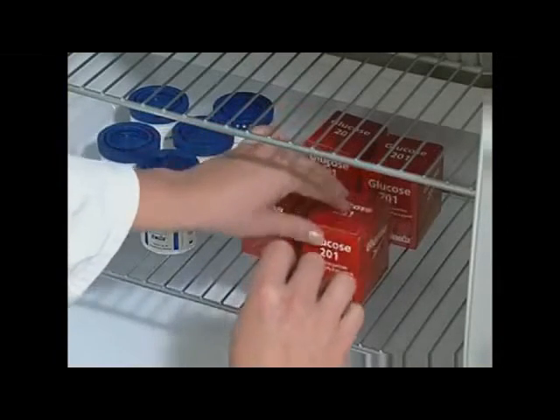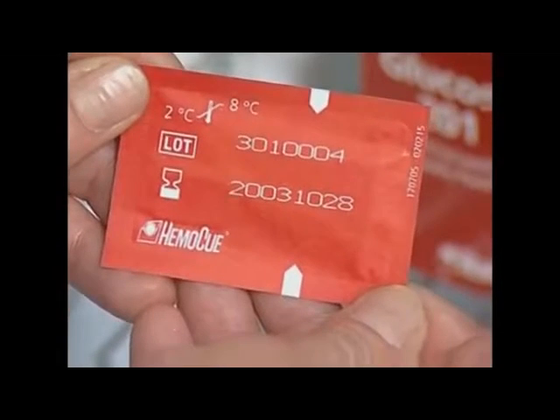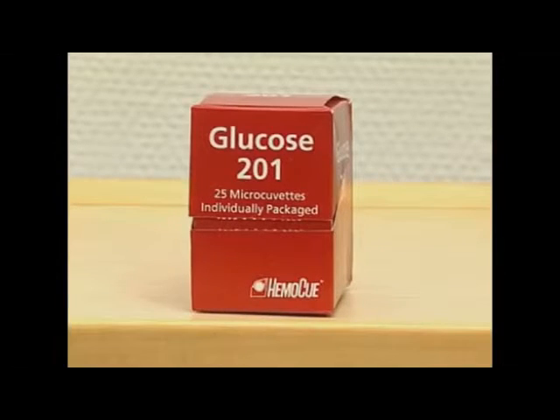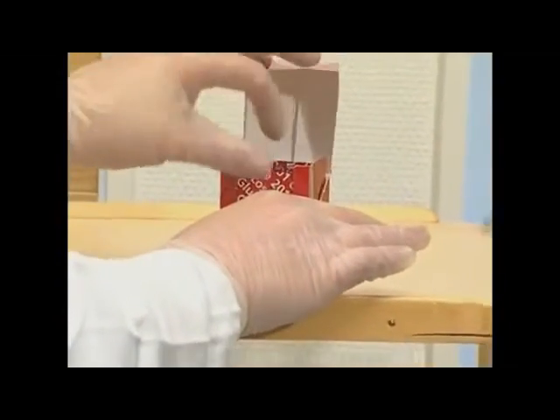Each individually packaged micro cuvette is stable until the expiry date when stored in a refrigerator, since only one package is opened at a time. The individually packaged micro cuvettes can also be stored for 3 days at room temperature.